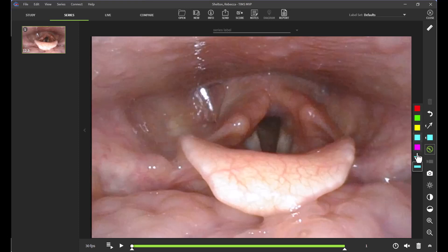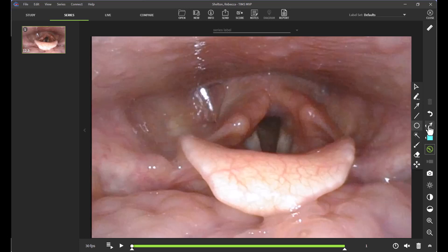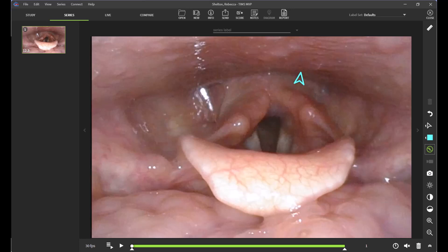From here, I can select the color and the width of my tool. If I'm wishing to provide education but not add anything to the imagery, I will utilize my cursor tool as shown. By clicking and dragging my mouse, I am now able to point out pertinent information in the study without actually adding anything to the imagery.